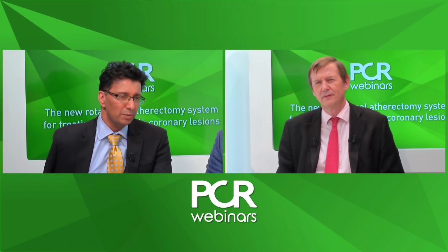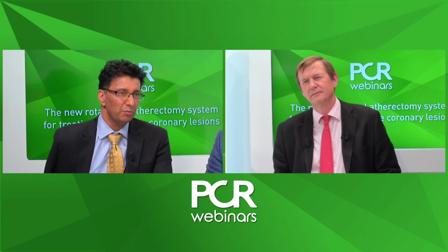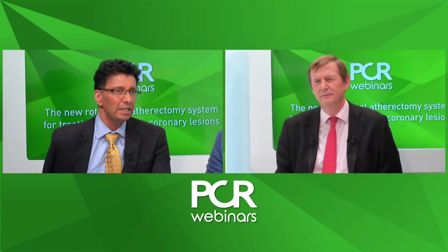So that is where we've come with rotational atherectomy, and this modern concept is of plaque modification, doing enough to the lesion to facilitate balloon expansion and stent expansion. And this is one of the take-home messages from the whole webinar: the change in purpose of this technique to modify plaques to allow stent deployment, rather than this idea that there was histological gain by removing the tissue in some debulking manner.